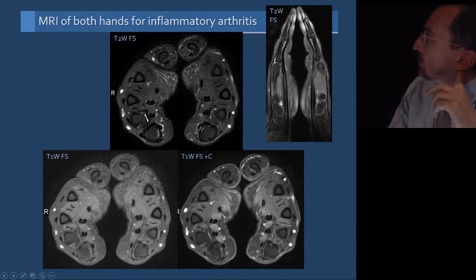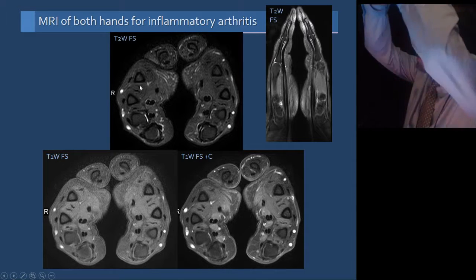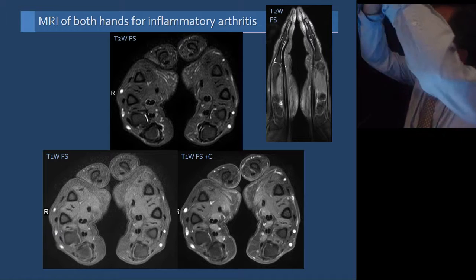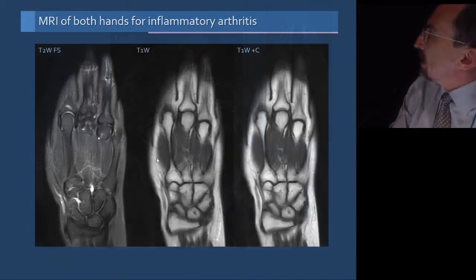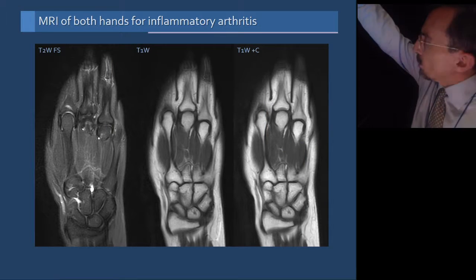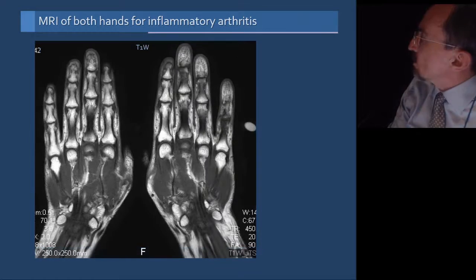This is how we have the imaging of the both hands. Usually we do this in this like prayer position, like this here. The patient goes into the magnet like this. Or we can have the patient lying in this so-called Superman position and have both hands imaged like this here.